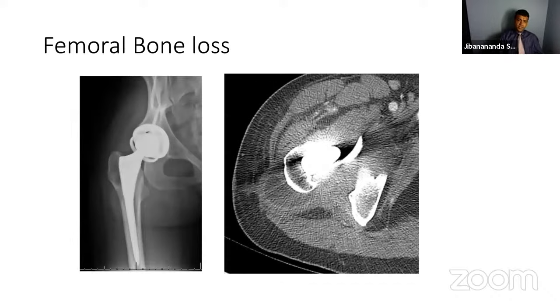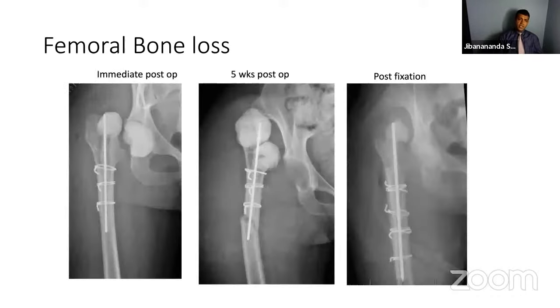Again, this is a patient done by me. It was done by my partner initially. It's a 26-year-old, requiring a constrained liner after multiple revisions. Again, presented to me after dental work, didn't have dental prophylaxis, ended up with a Strep viridans infection, had an ETO, and then a spacer put in. Unfortunately, she fell and broke the femur. And this makes it pretty challenging, but she was already 4 or 5 weeks out, had enough antibiotics.